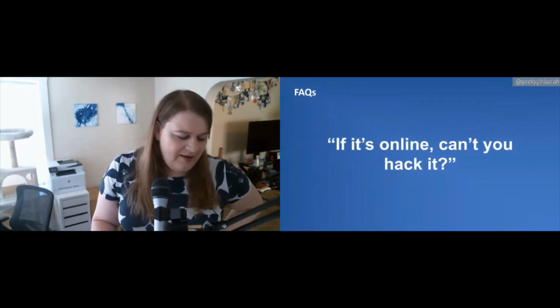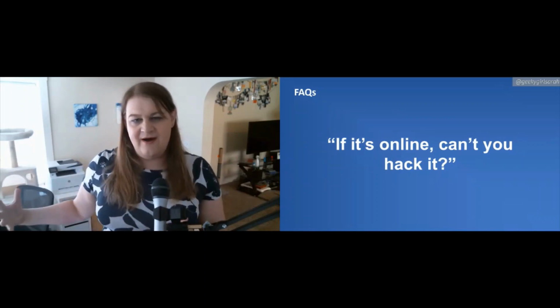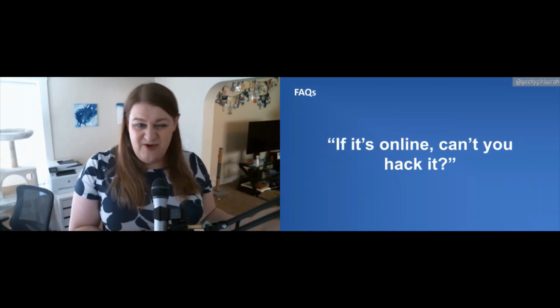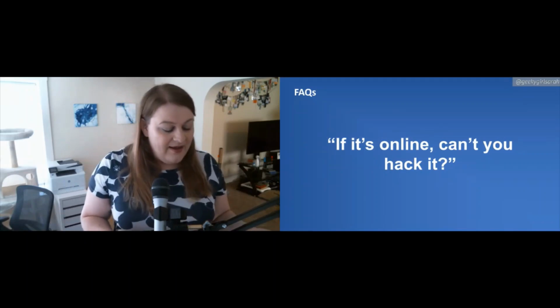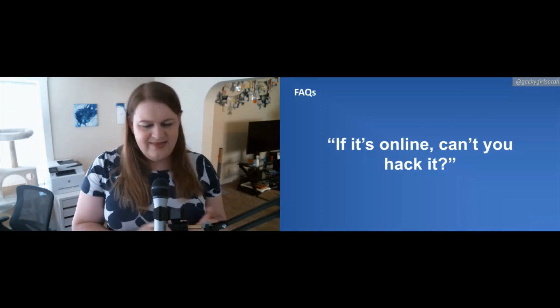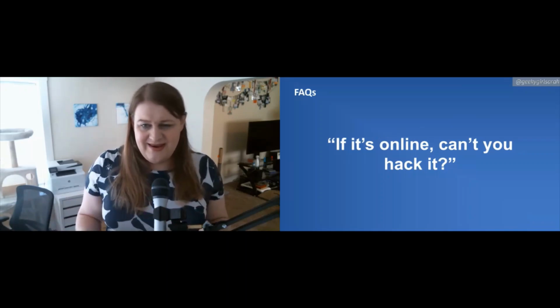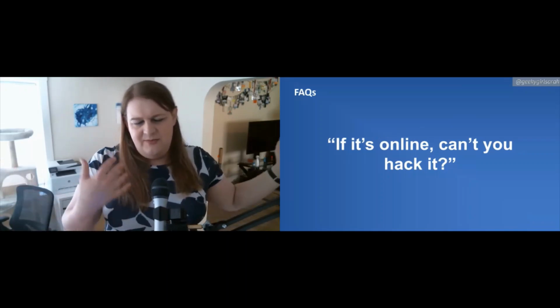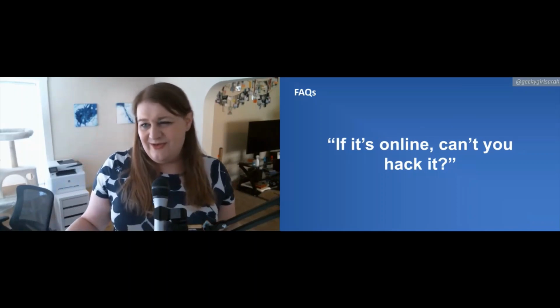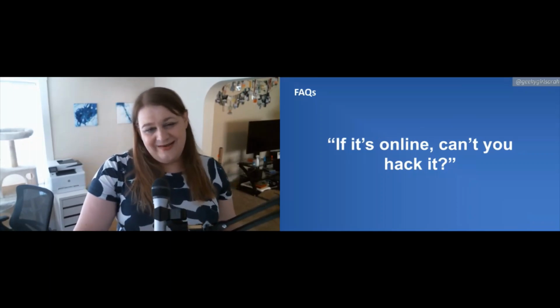Okay, sure. But I think the hack ratio to trade-off is not really worth it because typically it's tethered to my phone. So I would have to figure out what the IP address of my phone is and then hack into that. And then in turn, get over into the device and then hack through to the Linux and then run a script and dose me my whole insulin pump. I don't know what you want to do with this, but then what's the end result? I don't think anybody's really going to go to this trouble for it.